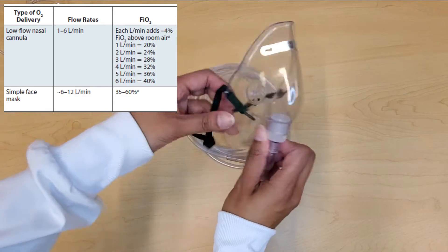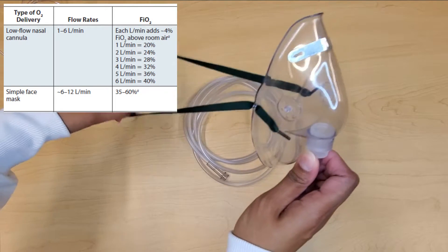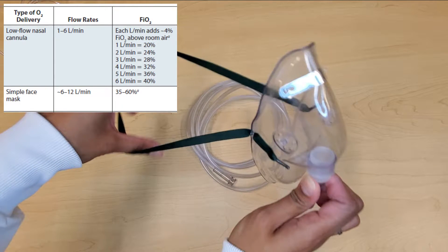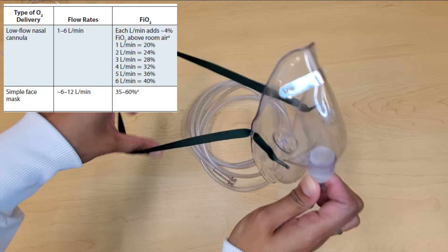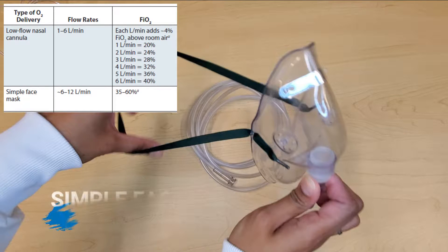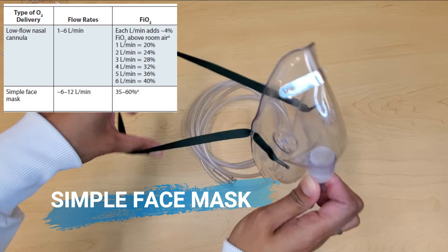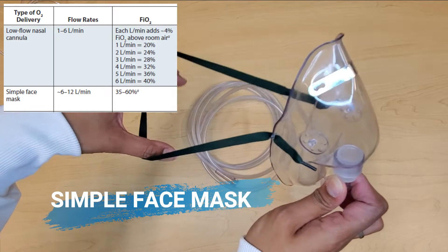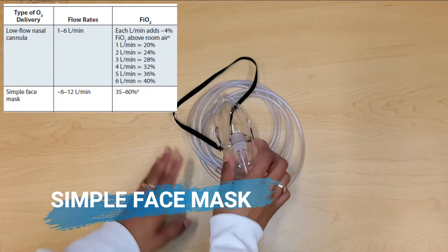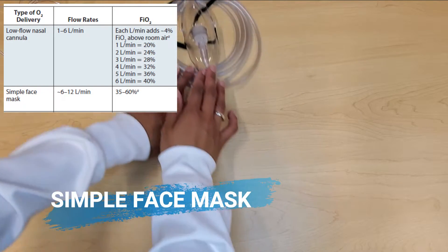Now let's say we had our patient on 6 liters per minute with the nasal cannula but they were still not above 92% saturation. We need to move our patient up to the simple face mask, and with this device we can give anywhere between 6 to 12 liters per minute of oxygen.